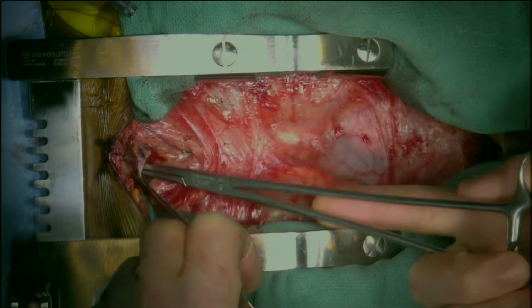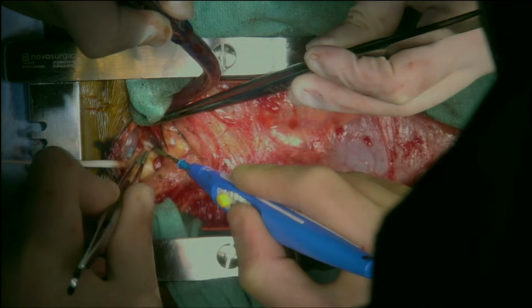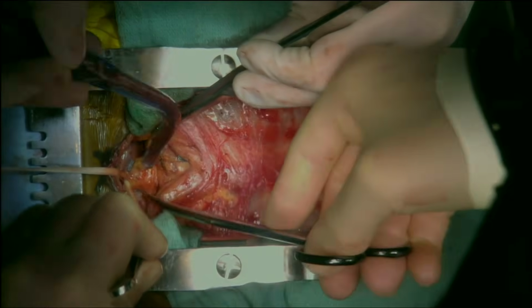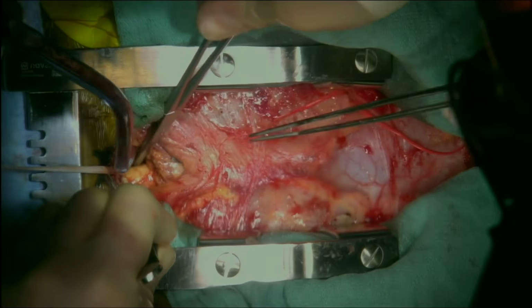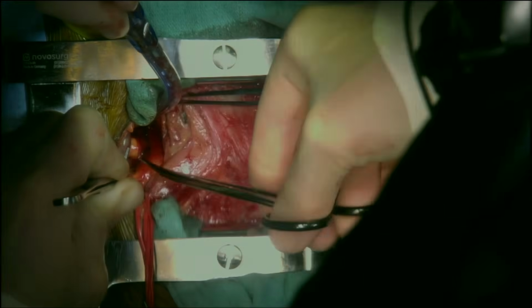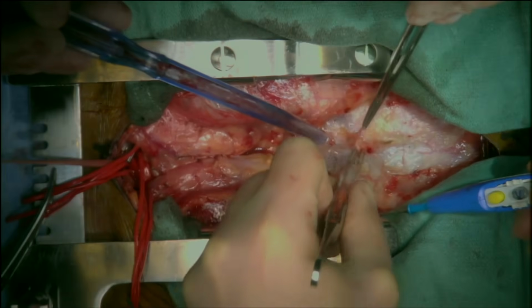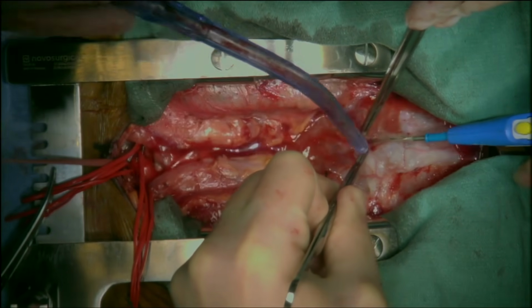The patient was taken directly to the operating room. Midline sternotomy was performed. The innominate vein was isolated and encircled with an umbilical tape. The innominate artery was isolated and encircled with a vessel loop. The left common carotid was isolated and encircled with a vessel loop. A small opening was created in the pericardium to allow for controlled drainage of the pericardial effusion.